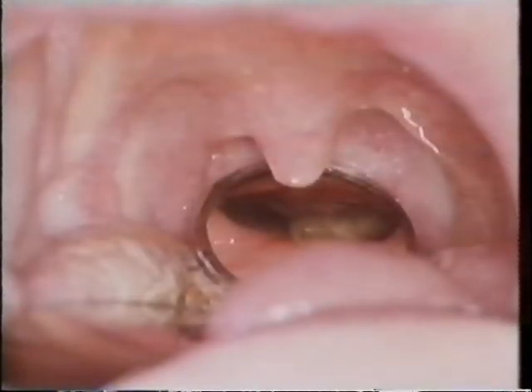And on the left, we can also see the back of the inferior turbinate, the back of the middle turbinate, the nasal cavity, and the nasal septum. Above the eustachian cushion is the fossa of Rosenmuller. A carcinoma of the postnasal space can be seen by this technique.